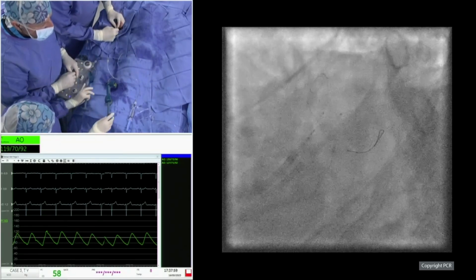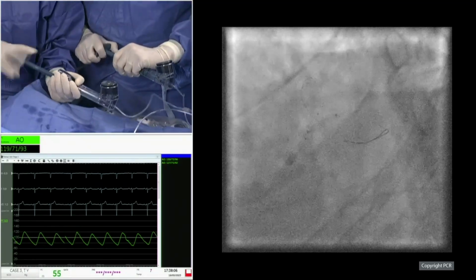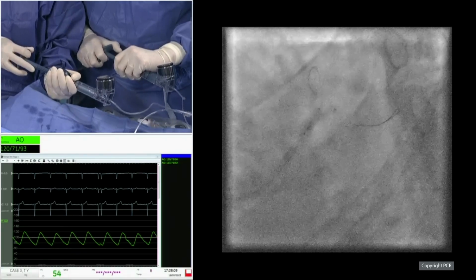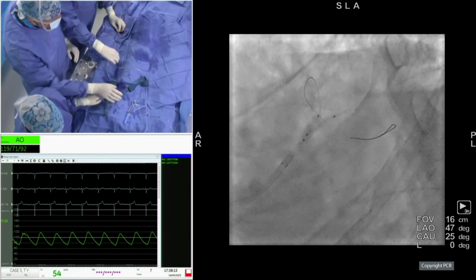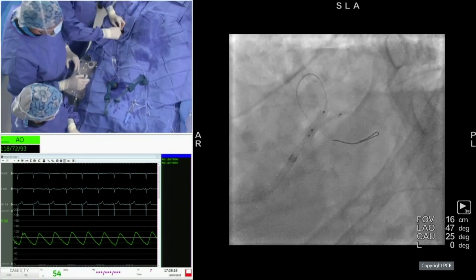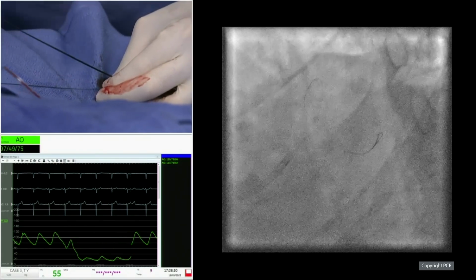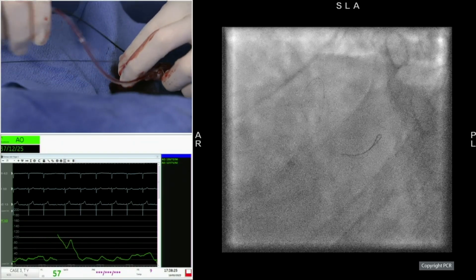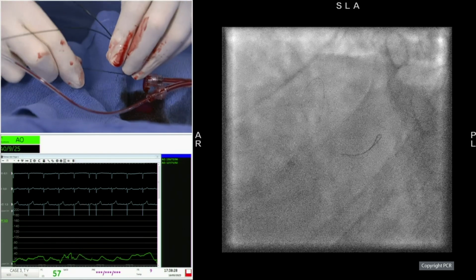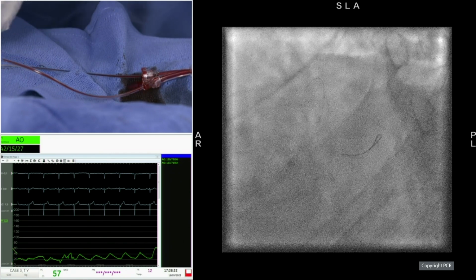Okay. So Bruno gave a very clear answer about when to use the rotablator and when to use something else. In terms of OCT, we will not see that today, but the appearance after rotablator, after orbital, after cutting balloon, and lithotripsy is quite different. You see really trenches with the cutting and with the lithotripsy technology, while with the rotablator and the orbital, it's more a knife cut in the plaque, quite concentric.